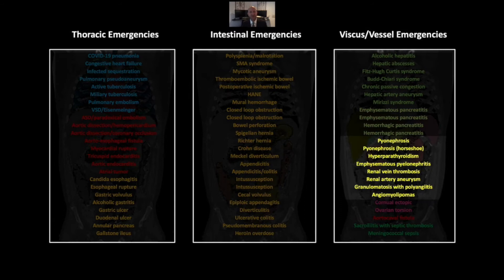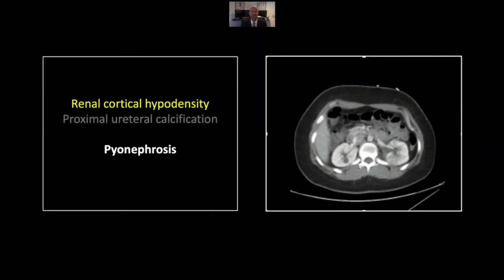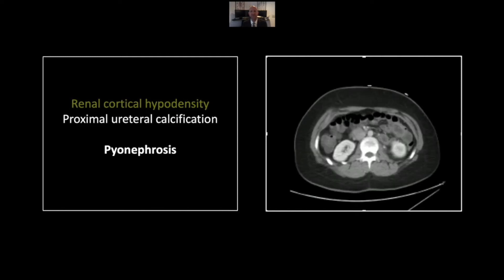Session 8: Renal Emergencies. We'll start with a relatively straightforward case of pyonephrosis, or pyelonephritis, superimposed on stone disease. There is the renal cortical hypodensity so characteristic of pyelonephritis. When you see that, you must make certain that you look for small, subtle stones causing the precipitating obstruction.